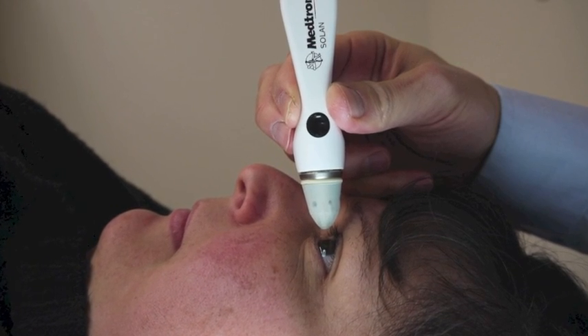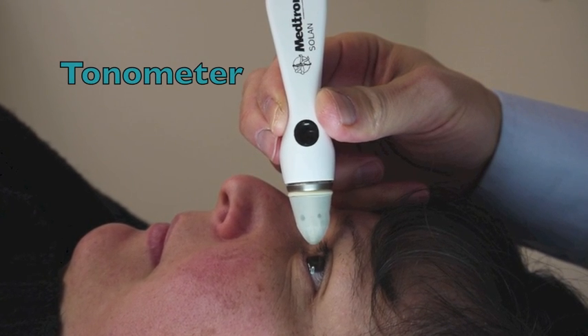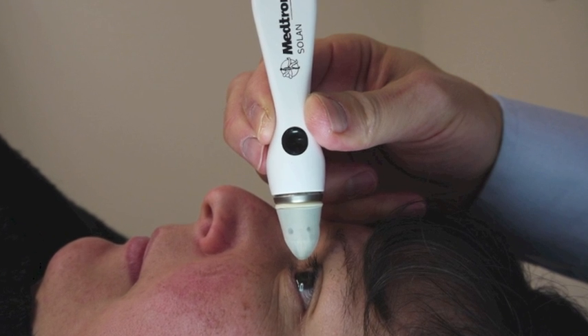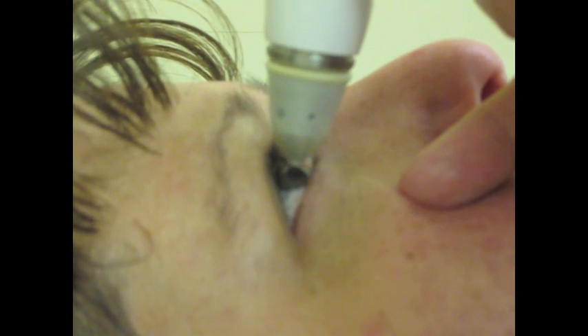Tonometry is the medical method used to measure the intraocular pressure. An instrument called a tonometer is used for this purpose; it measures the tone and firmness of the eye's surface. Tonometry is used to screen for glaucoma, or increased pressure inside the eye, and may be done as part of a regular eye examination.